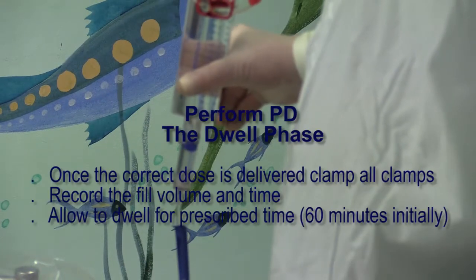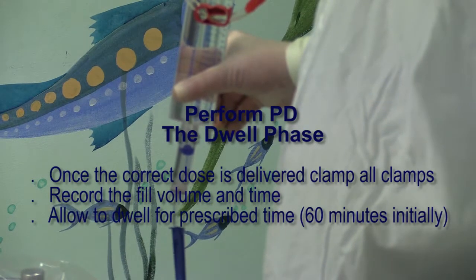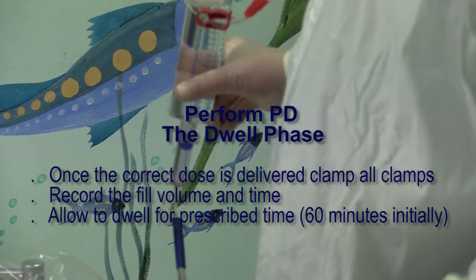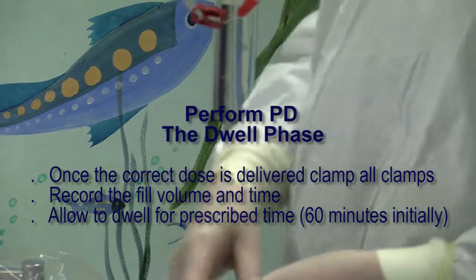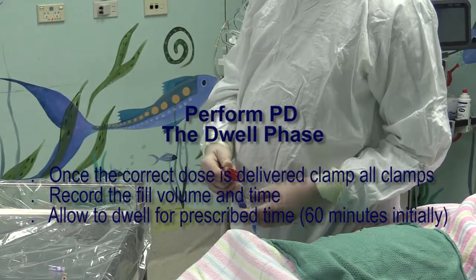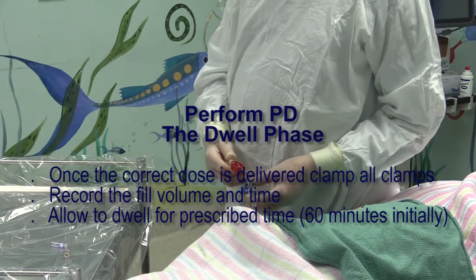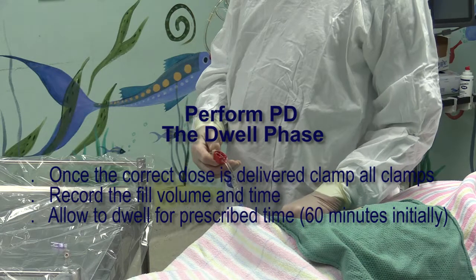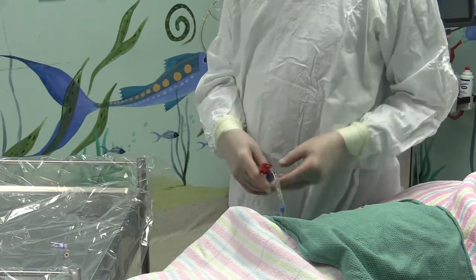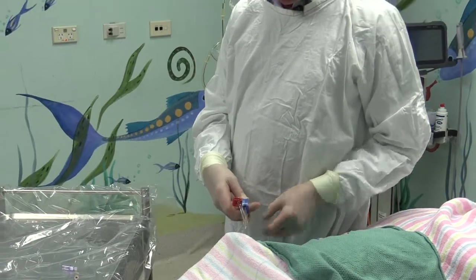Once the fluid is administered, in this demonstration I've put in 40 mils of fluid. We then clamp the patient line and then would leave the fluid in the peritoneal cavity for a period of an hour. We'll aim to do hourly exchanges. This is while osmosis and diffusion takes place across the peritoneal membrane.